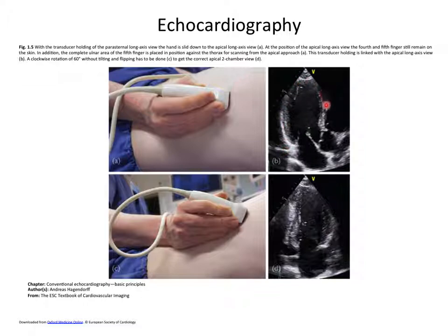You can look at it in a single imaging plane, right? The imaging plane in ultrasound is going to be a few millimeters thick, maybe 5 millimeters thick, and we get a dynamic movie. If you rotate the transducer in your hand, say by 60 degrees, you get a new slice through the patient. So it's like cutting a pie, right, in different angles.